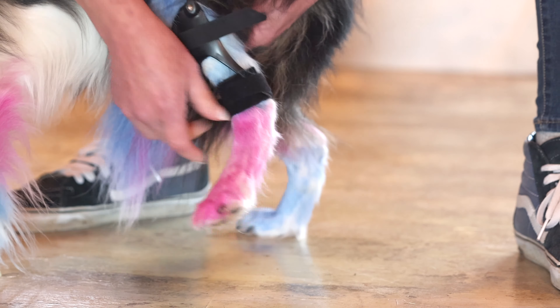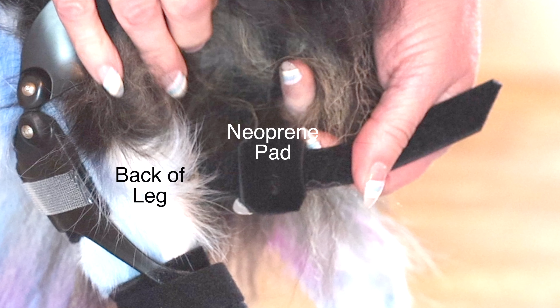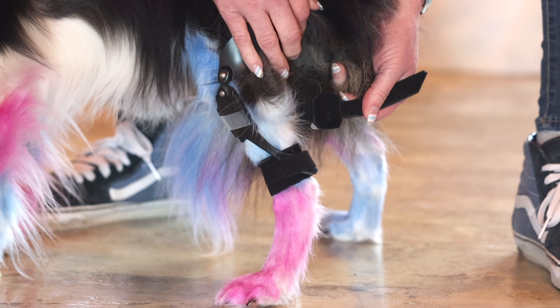Secure the bottom strap snugly. Next, secure the top strap, and if your dog is hairy, make sure that you're not catching any hair. The top strap has a neoprene pad — it should be placed on the back of the leg.